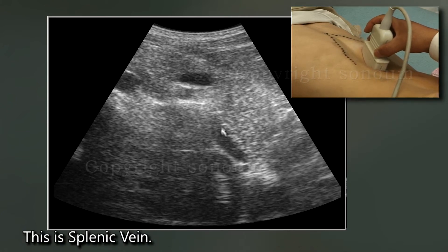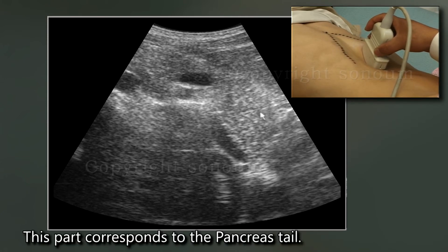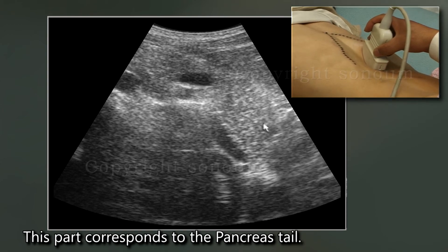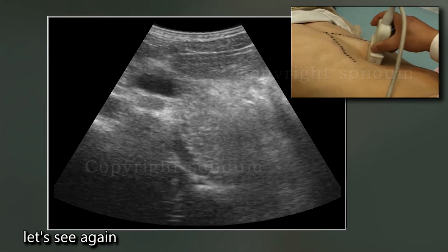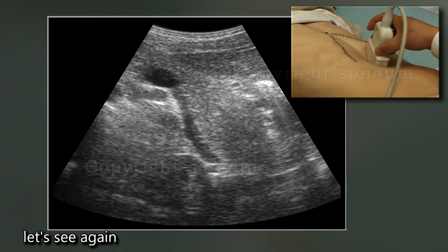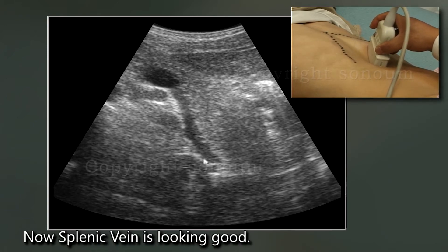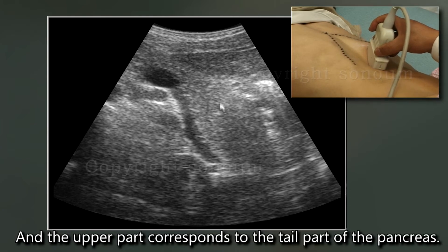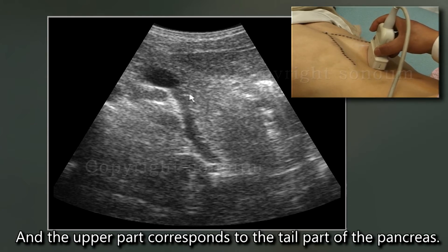This is the splenic vein. This part corresponds to the pancreas tail — let's see again. The splenic vein is looking good, and the upper part corresponds to the tail part of the pancreas.